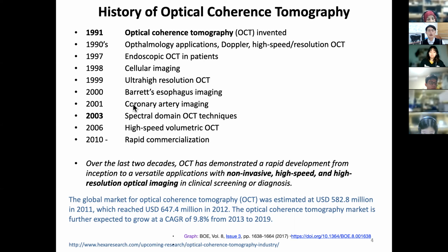However, I have to say, in bold black letters, the original OCT development is so-called time domain OCT. And some of you asked me why we have to study Fourier optics. Yes, seeing things in different domains can change everything entirely. This is a great example.